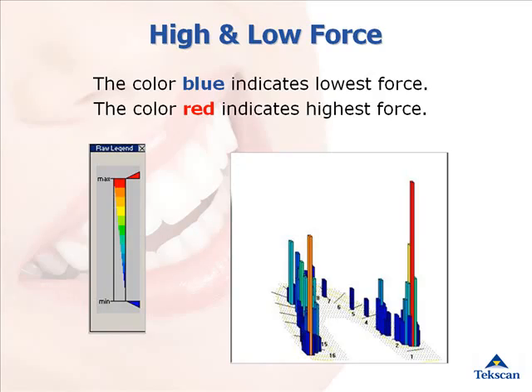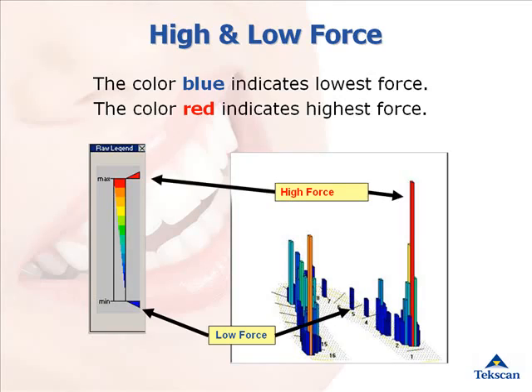The T-Scan system measures relative force. The force legend shows the different force levels that can be graphically displayed by color coding from lowest forces, blue, through middle forces, green or yellow, up to the highest forces shown in red and orange. The force legend illustrates the color coding which describes 256 levels of force that can be recorded in a given movie.